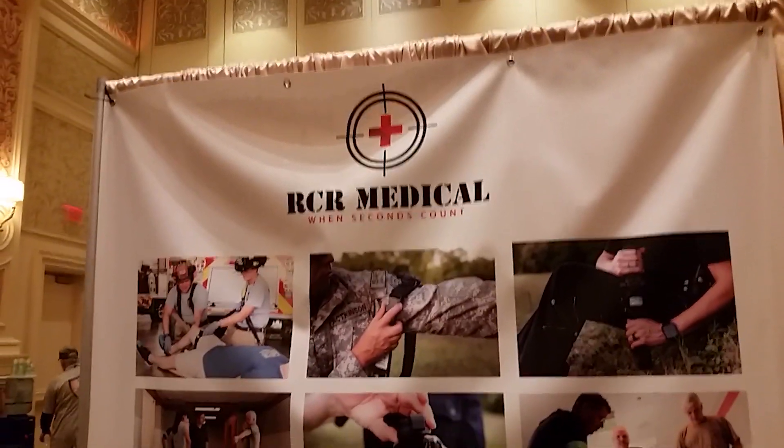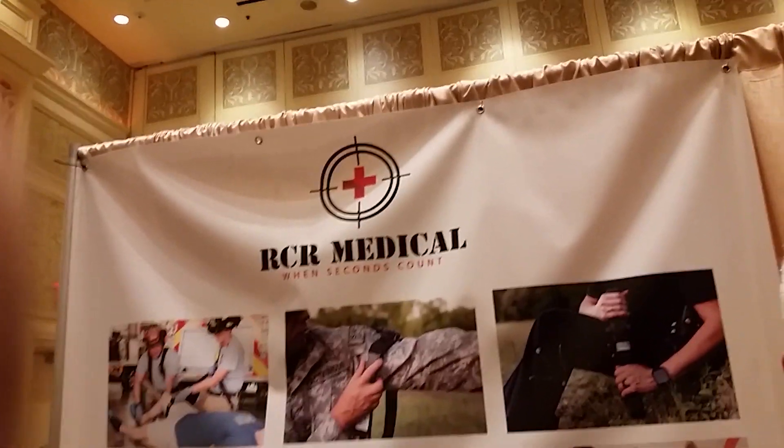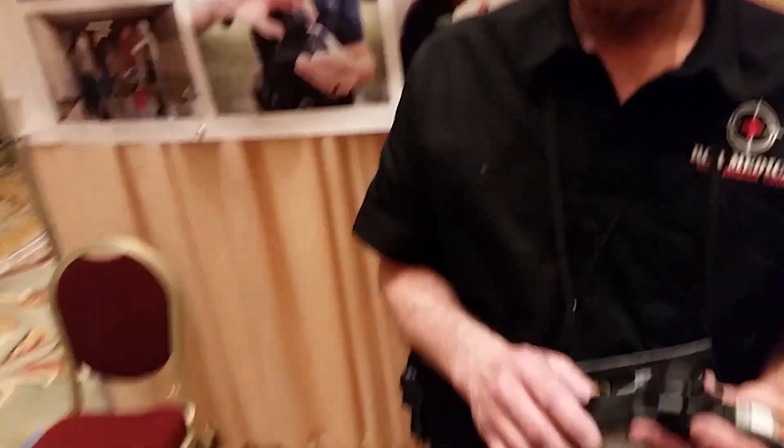Shot Show 2020, up in the pop-up preview upstairs. We're talking to Robert from RCR Medical. They've got an interesting tourniquet that caught my eye. Tell us about it, please.